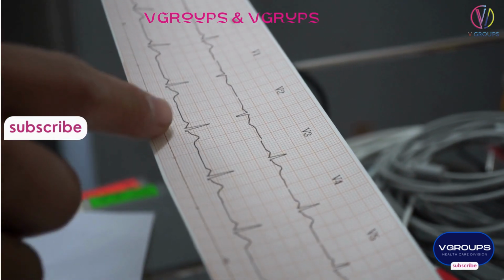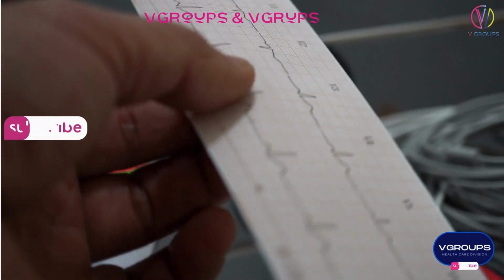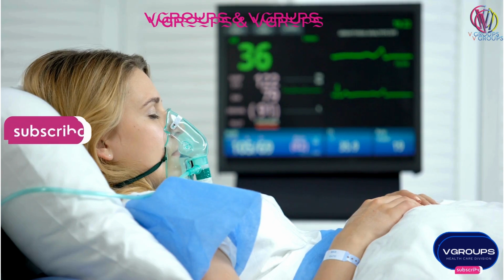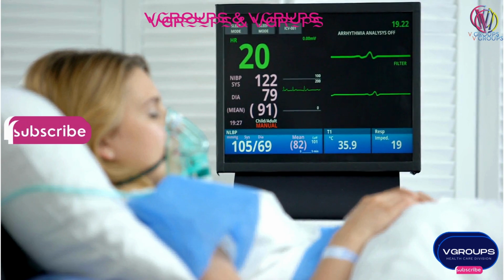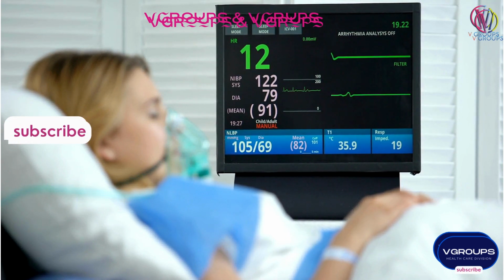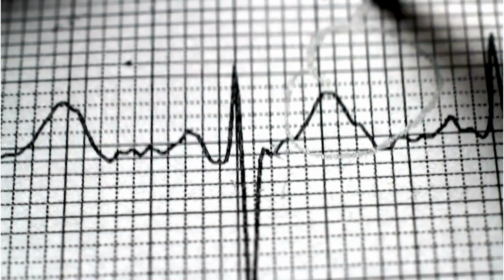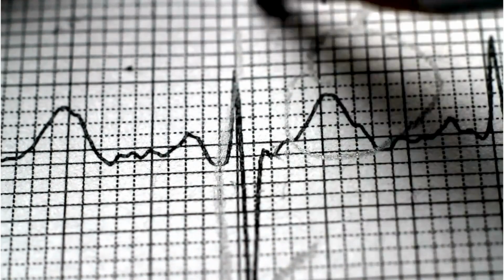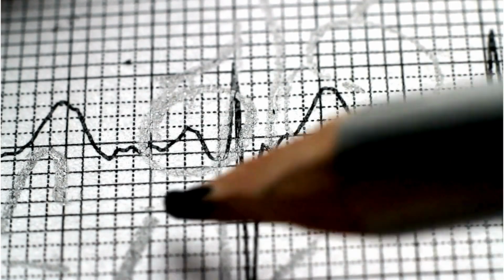Heart rate measurement. The machine calculates and displays the heart rate based on the intervals between the different components of the ECG waveforms, such as the RR interval. Interpretation. Modern ECG machines often include automated interpretation algorithms that analyze the recorded signals and provide an initial assessment of the heart's condition. However, final interpretation is typically done by a healthcare professional.